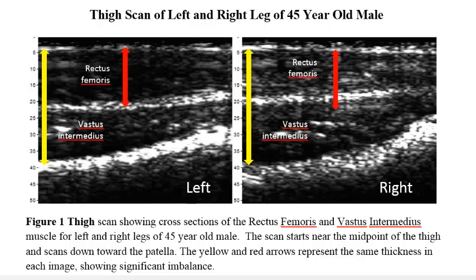The first white line feature at approximately 4 millimeters in the scan is the strong ultrasound reflection from the interface between the fat layer and the rectus femoris muscle. The second white line is the interface between the rectus femoris and vastus intermedius muscles. The last white line is the femur bone.